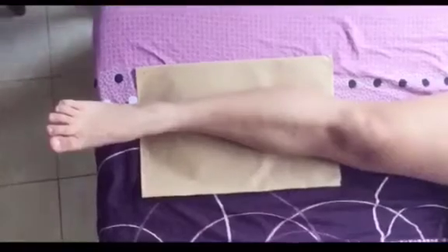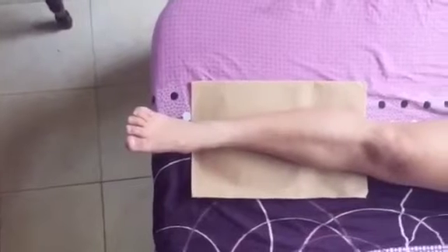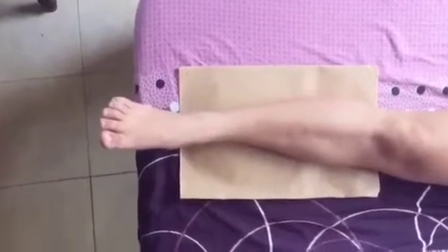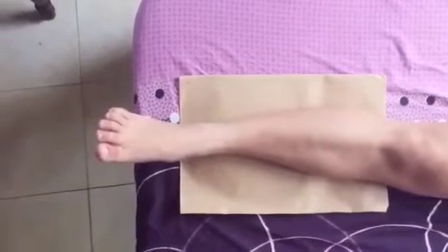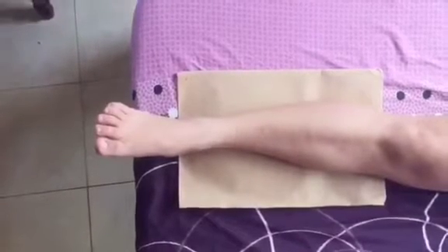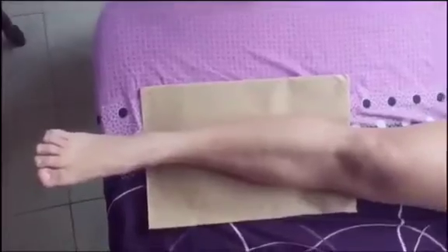The IR must extend from 1 to 1.5 inch beyond the joints. When the leg is too long for these allowances and the size of the lesion is not known, two images should be made. Diagonal use of the 35 by 43 cm IR is also an option if the leg is too long to fit lengthwise and if such use is permitted by the facility.